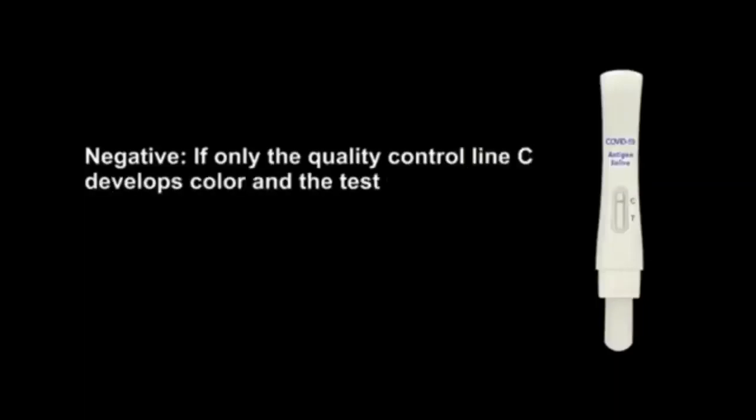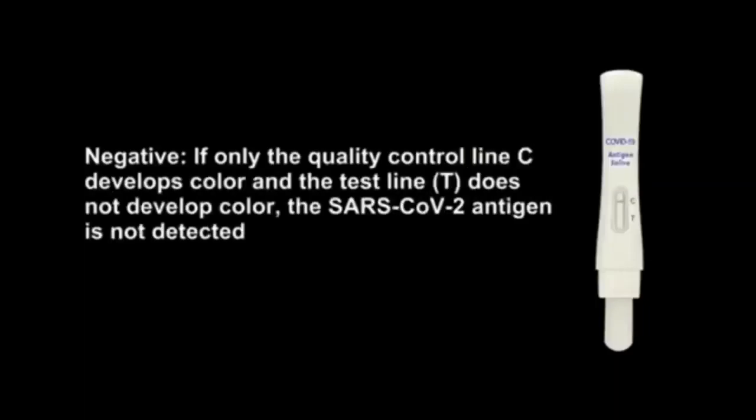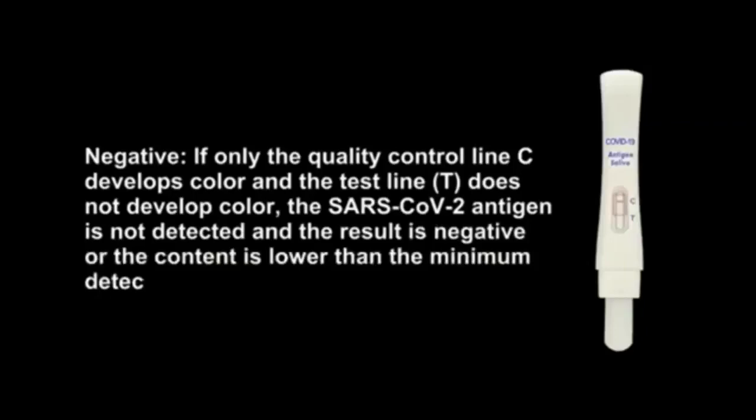Negative: If only the quality control line C develops color and the test line T does not develop color, the SARS-CoV-2 Antigen is not detected and the result is negative, or the content is lower than the minimum detection limit of the product.